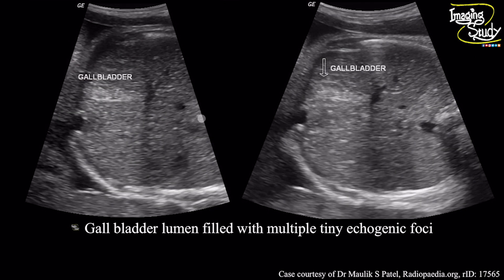Here is another picture of the gallbladder showing the hyper-echogenic material-filled gallbladder. There is no posterior acoustic shadow, which may make you confused about whether there is gallstone or this is gallbladder sludge. We can confirm it with color Doppler for twinkling artifacts.